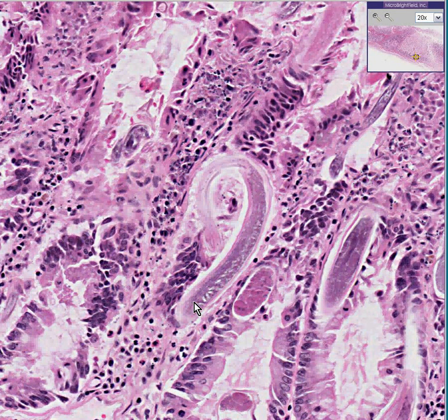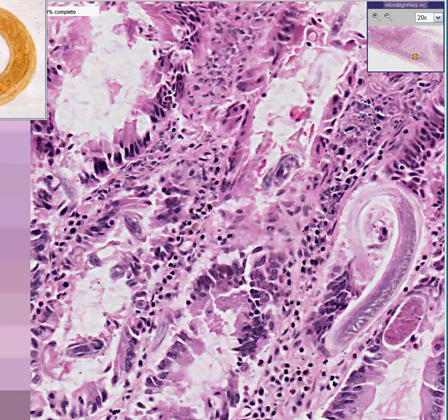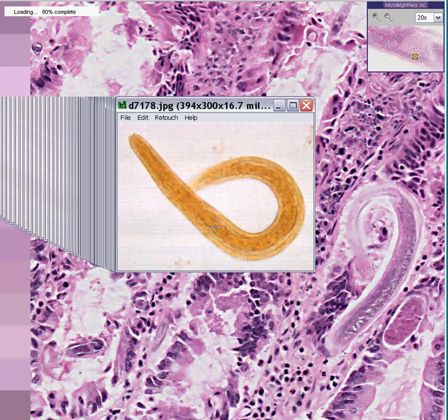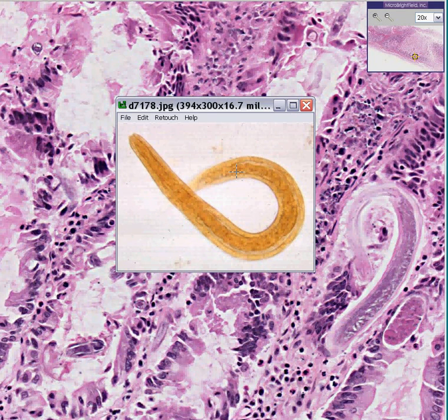If you were to take this worm and isolate it nicely and stain it or examine it all by itself, it might look something like this. Here is a Strongyloides worm with more detail on the inside, this little cuticle around it, and a little point on the tail — what it should look like if it was more nicely prepared. But you must admit, the one here embedded within the lamina propria of the small bowel looks pretty classical as well.